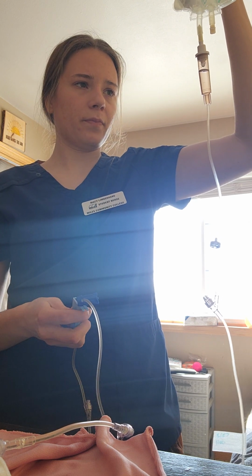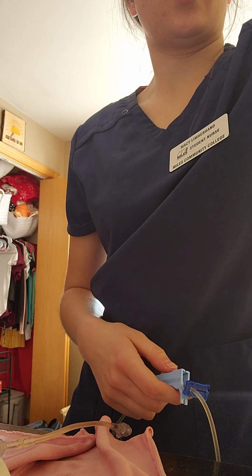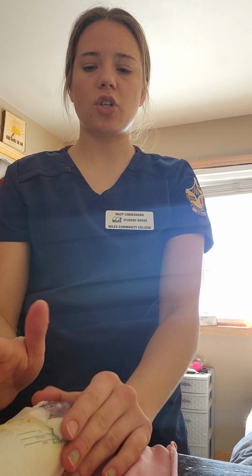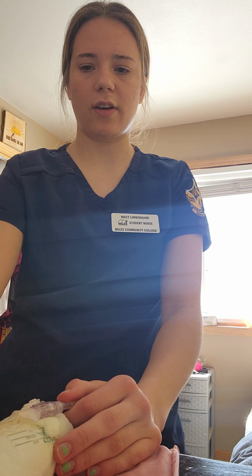Okay. And then once I have that set, I will just put the main IV back to the right height. And once again, just educate my patient on looking for signs of phlebitis and checking the IV site. Doesn't need new dressing, anything like that.